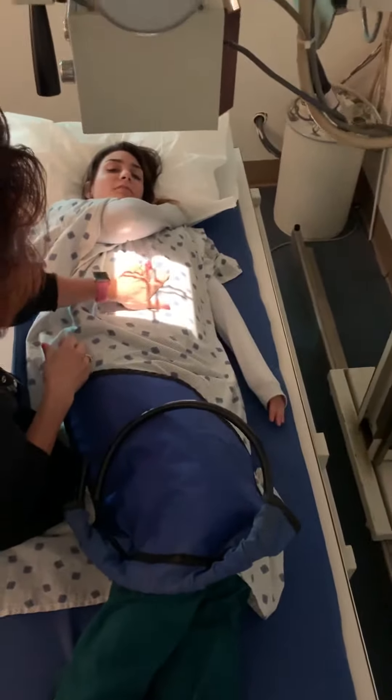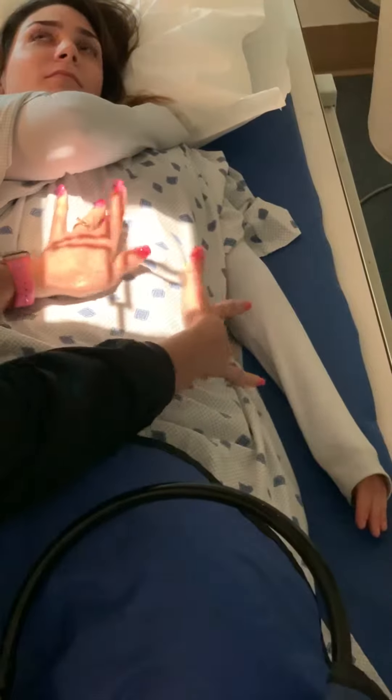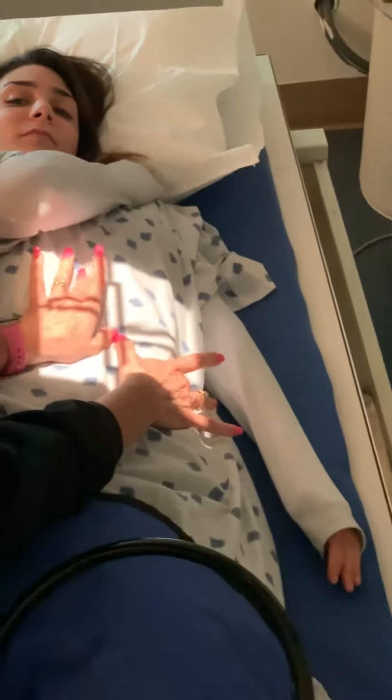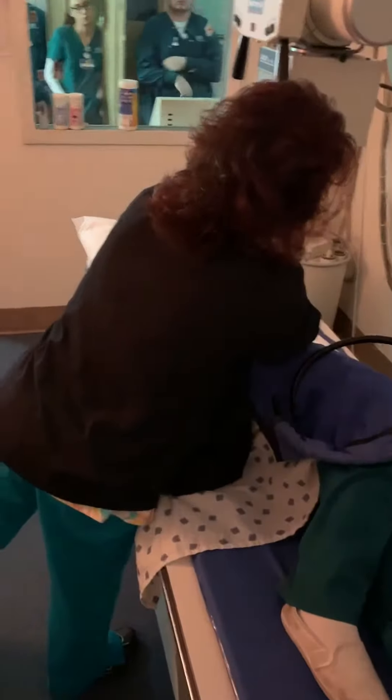I'm going to put my middle finger on the xiphoid, middle finger on the lower border of the ribs, bring my thumbs together, and then move my table. Okay — xiphoid, lower border of the ribs. X marks the spot.